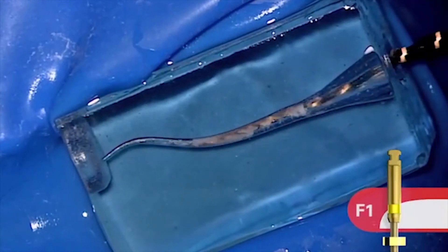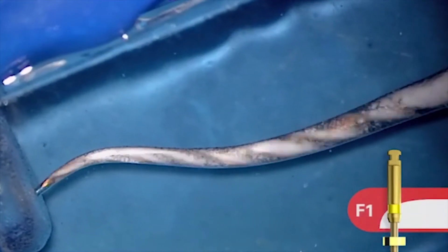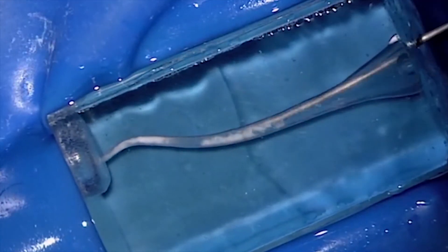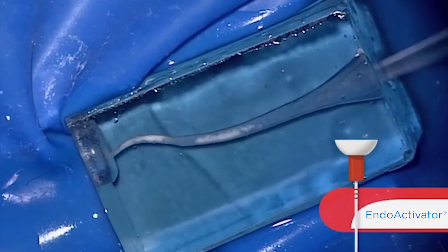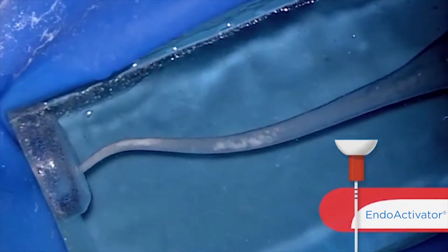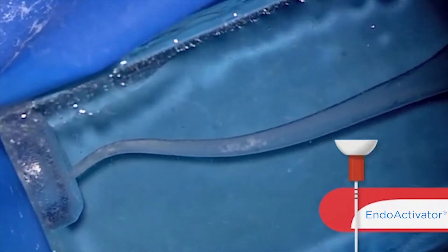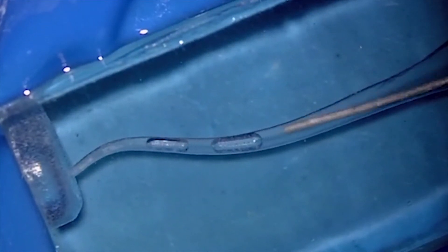Our first finisher is a 20/07 — it's F1. Notice it's loading up right towards its terminal blades and it can walk down pretty easy, crawl around curvature, and achieve length. Again, we have the usual assignment of irrigate, recapitulate, and re-irrigate. I'm again emphasizing that we could recapitulate even with an EndoActivator as a third idea. So we've talked about a stainless steel 10 file and a ProGlider. Here is a polymer, non-cutting, highly flexible tip that can rapidly move debris into solution and very effectively clear the canal so that we can irrigate a little bit more effectively.